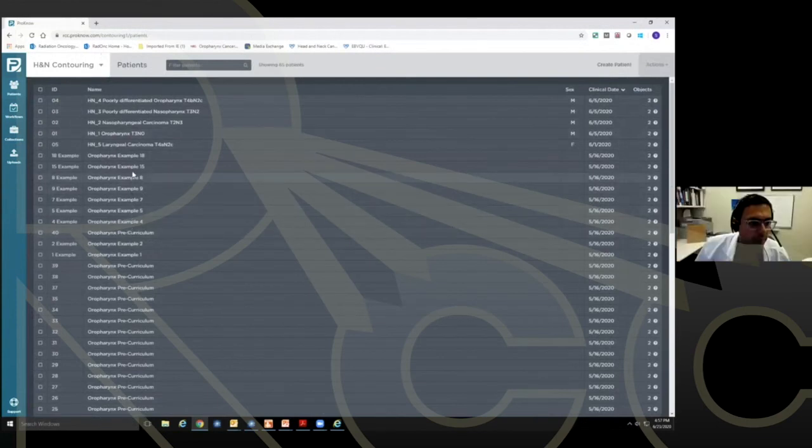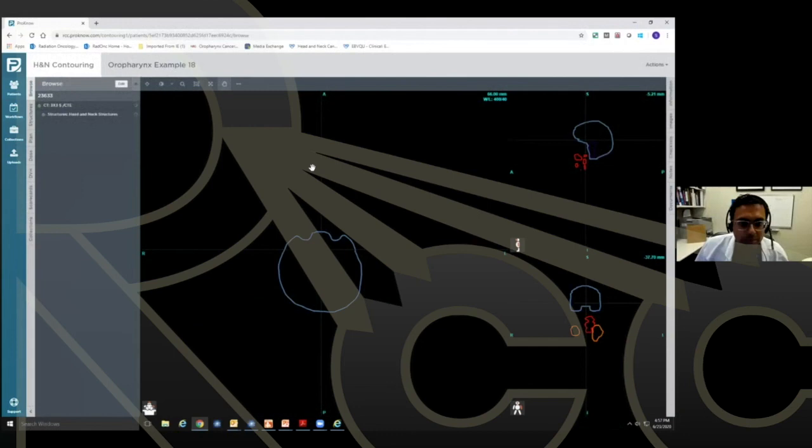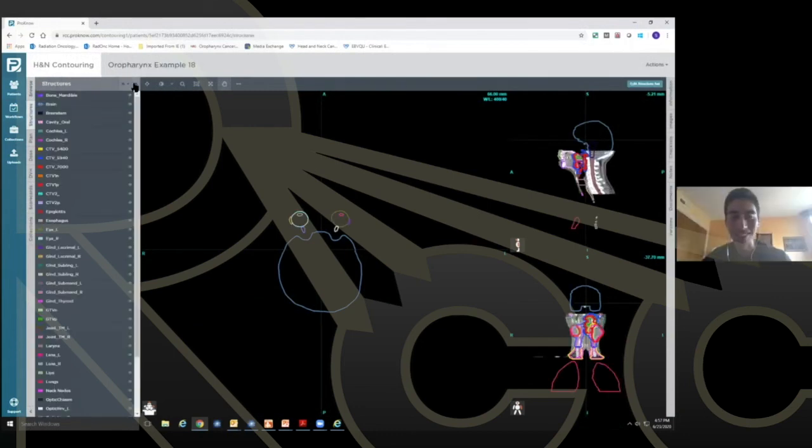All right, one more patient. Let's see if we can get it done. We got 3 minutes. Yeah, this has been wonderful.